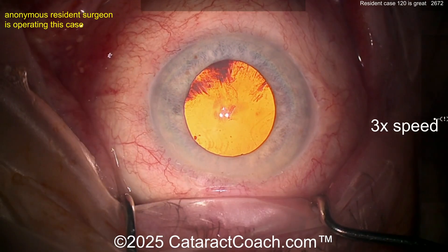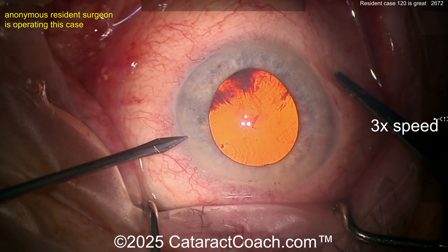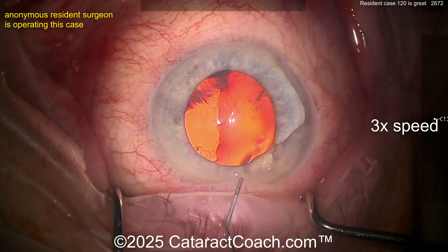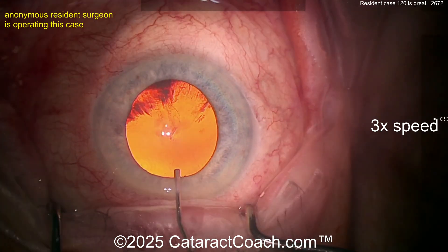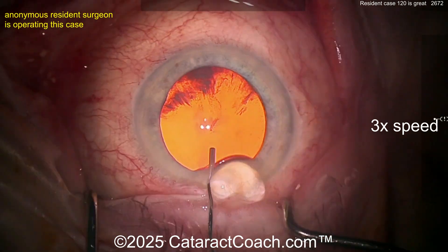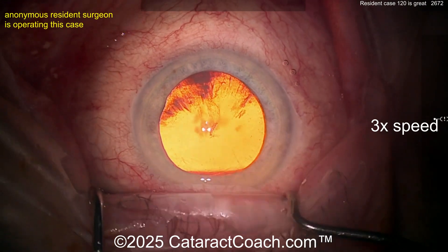Here comes the main incision — looks pretty reasonable. I like that, barely nicking the limbal vessels, which we also like. Here comes a side port. The surgeon is sitting superiorly. Now coming in with some anesthetic going inside the eye, and then viscoelastic going in as well — nice good wave.